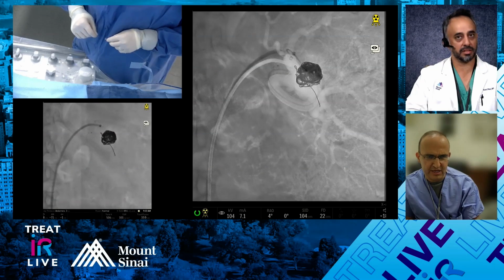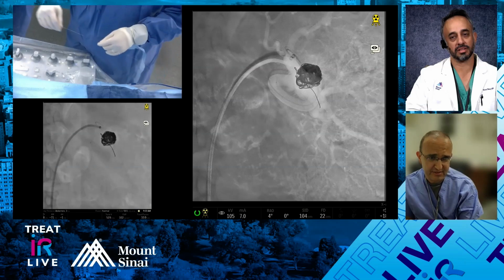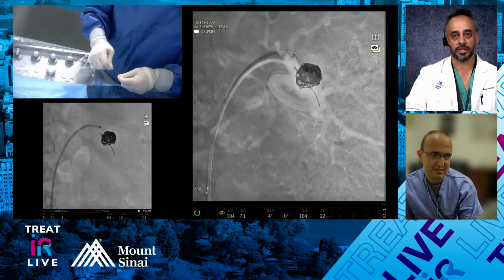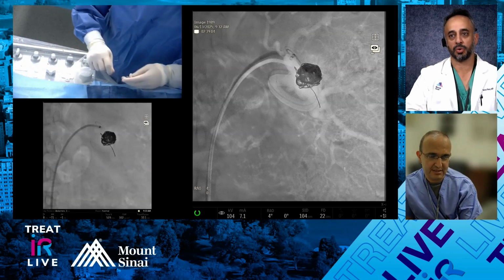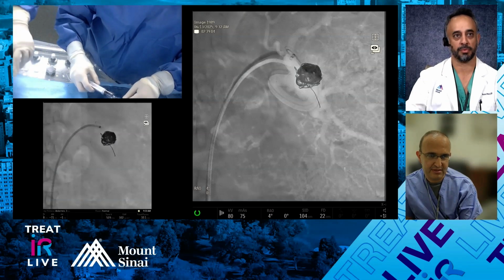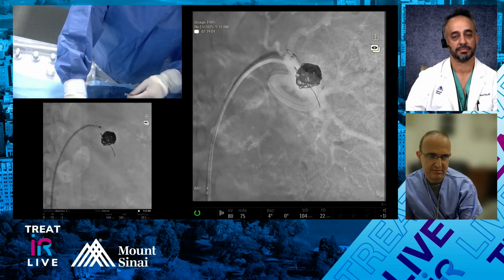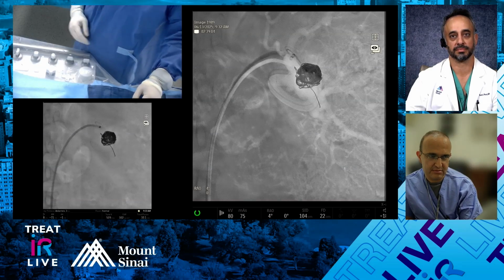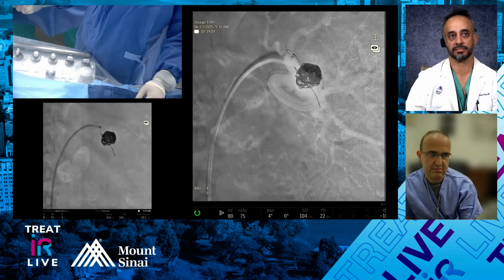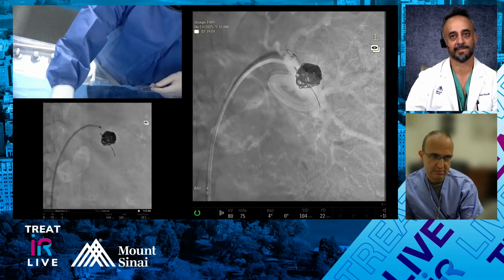It also tends to anchor your 16 catheter so you can go further. Looks really nice. It looks like it's getting denser too, so it's probably clotting. Yeah, it's a good show of the technique. You're working the coil and the microcatheter together to get it to shape and form the way you want. I think it's a nice application of detachable technology because I've been going back and forth, since I haven't liked the fact that it was going into the outflow vessel. So it is a more controlled setting.